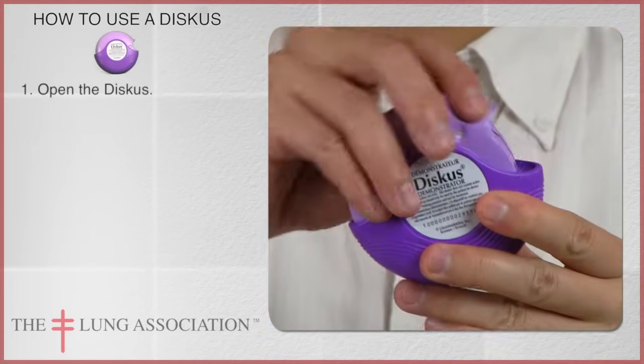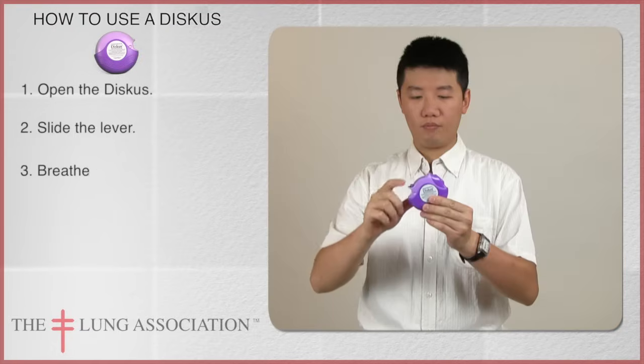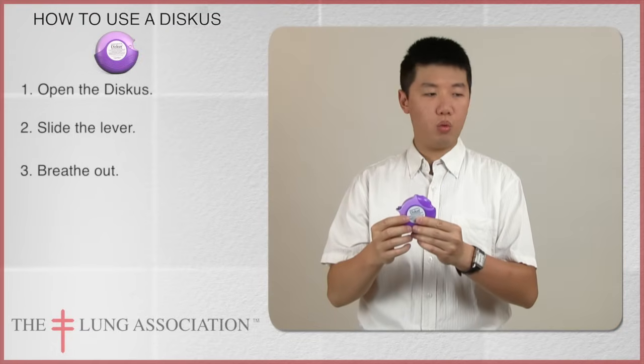Slide open the discus. Slide the lever over until you hear a click. Breathe out, away from the discus.